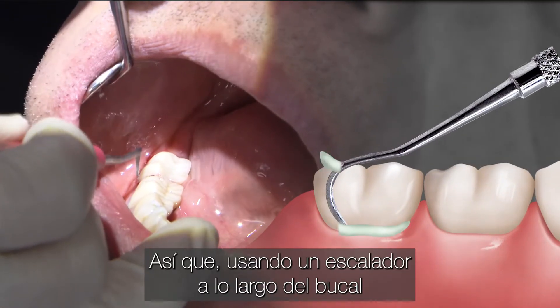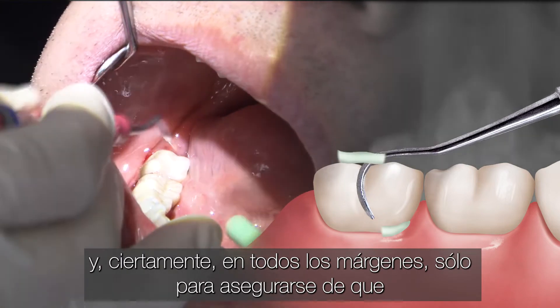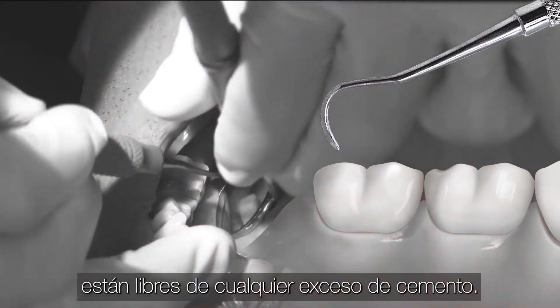So using a scaler along the buccal and certainly all of the margins, just to make sure that all of the margins and proximal surfaces are free of any excess cement.